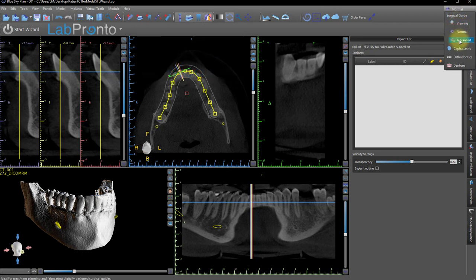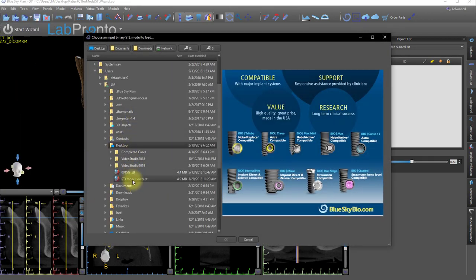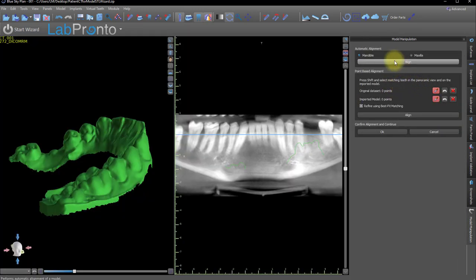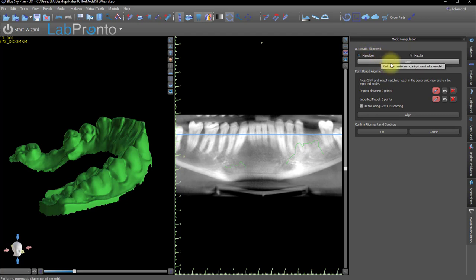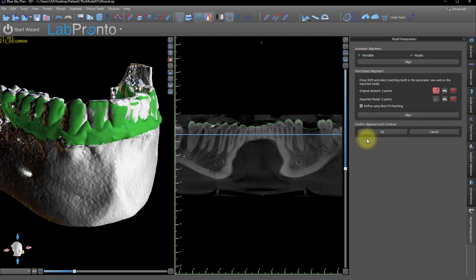I'll quickly switch to advanced mode by clicking in the upper right corner on the mode dropdown and clicking Advanced, then repeating the same steps. On the File menu, click on Import Model STL, double-click on the file, and just like before in normal mode, click on automatic align. Check that the correct arch has been selected — if not, check it — and click Align. This shows there's really no difference in the steps whether you're in normal mode or advanced.